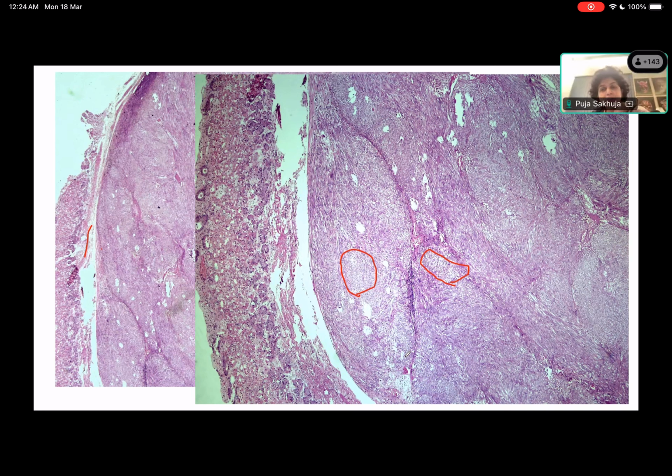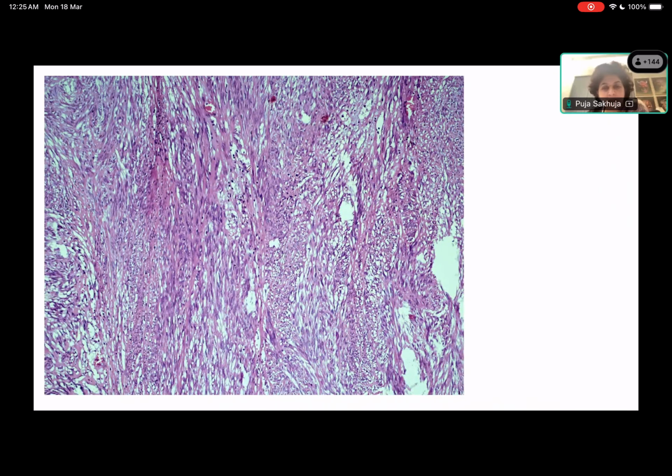These perinuclear halos often occur as an artifact, and they do sometimes help us in pointing towards the diagnosis. Although, very frankly, when you see a spindle cell tumor arising in the muscle in the stomach, your first line of thought, and you can see this again now in high power over here, is that this is a GIST. Now this is CD117, DOG1.